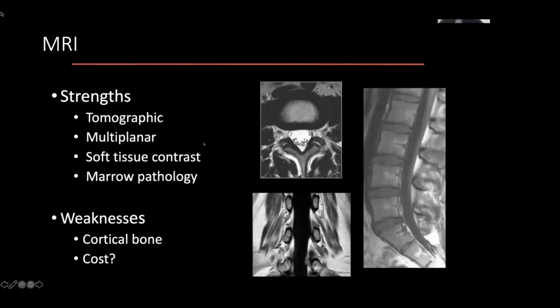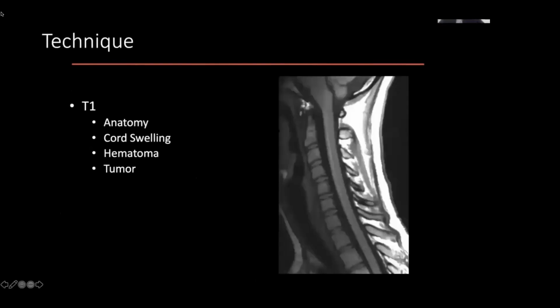If you're interested, you can look at things like compressed sensing, which is technology from the IT world, also called sparse data set evaluation, and that really allows us to reduce the amount of time that we need to acquire the data of an MRI.